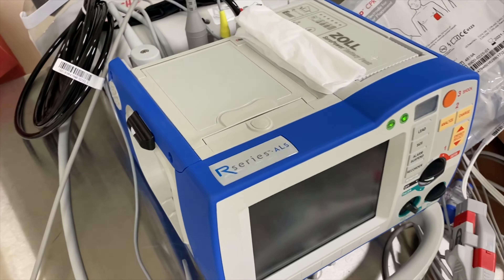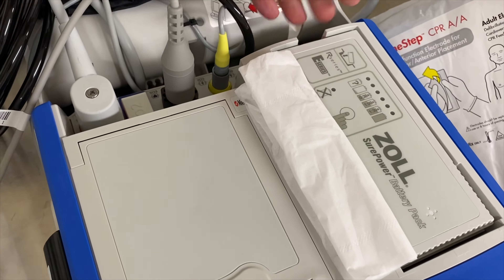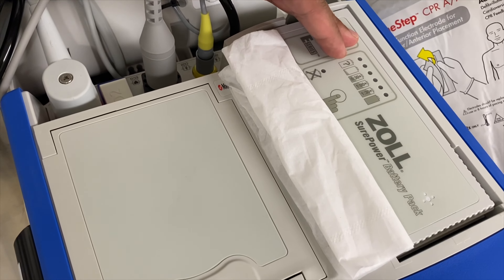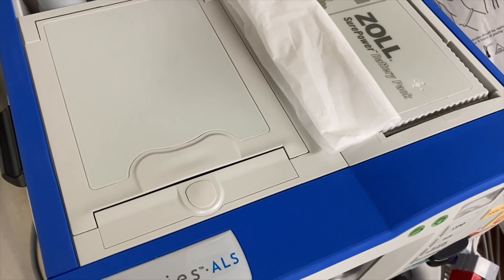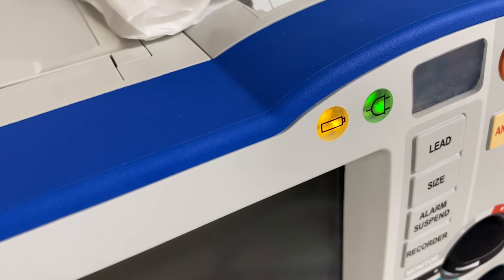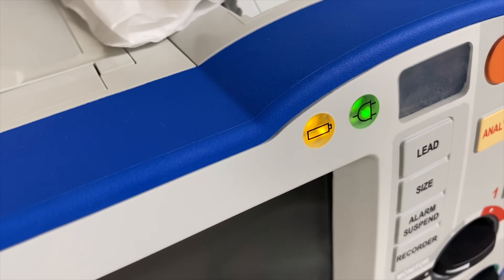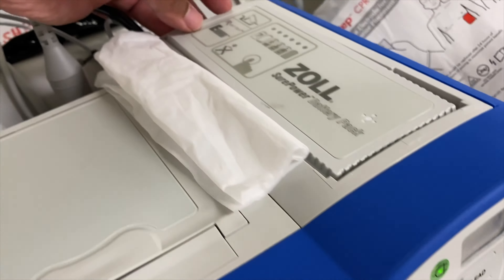When we look at the top portion of our Zoll defibrillator, you would see and you can locate where your battery is. This is where your battery is. You want to make sure that this is always plugged in, because if I do take it out, you can see that there will be a flashing yellow light that's coming on in the front part of your device.